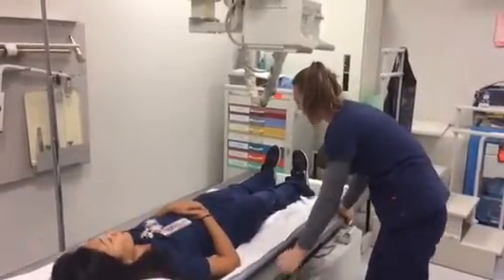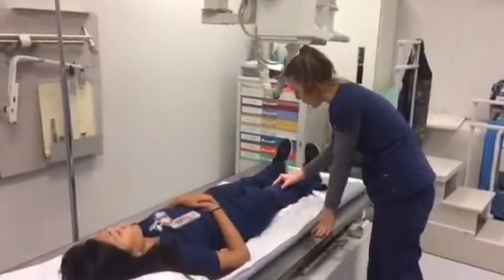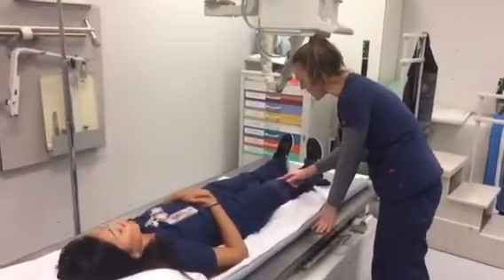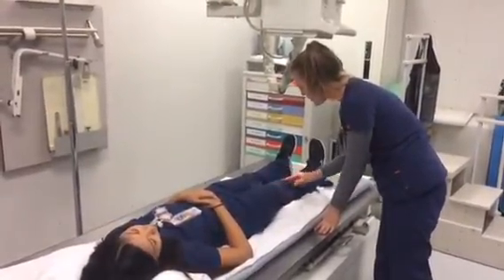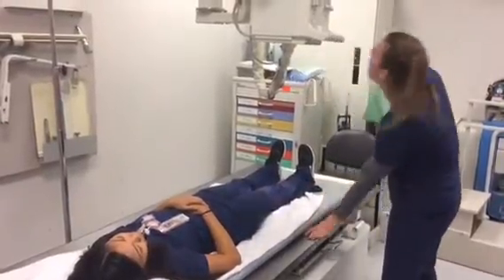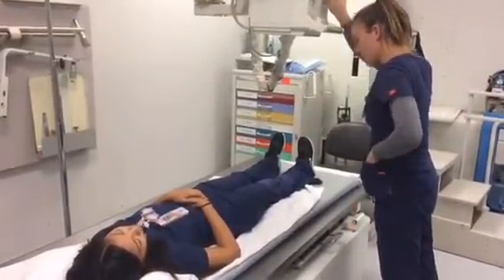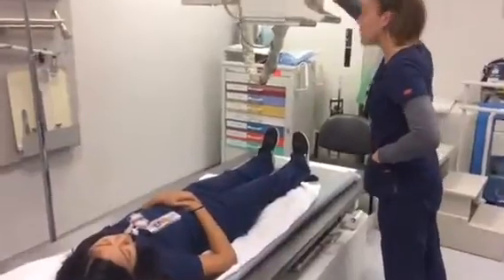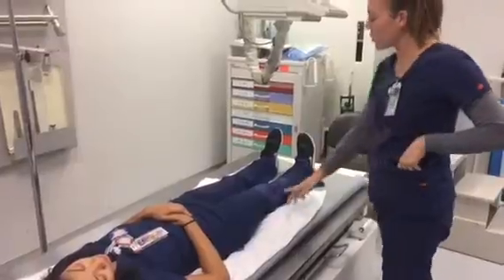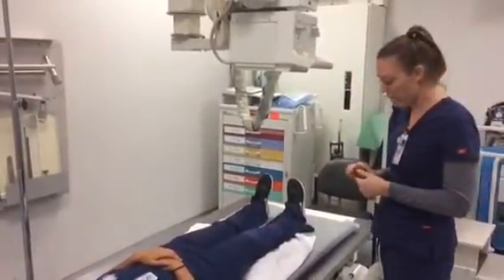I also said it was her right knee, which matches what's on my paper for her. I'm going to be palpating for the apex of the patella, where the central ray will enter half an inch below the apex of the patella. I will then collimate in. And I do want to make sure that I get a little bit of the femur as well as a little bit of the tib fib.